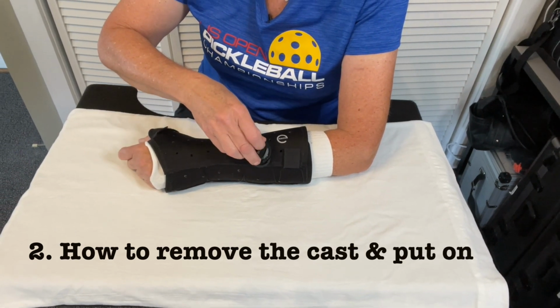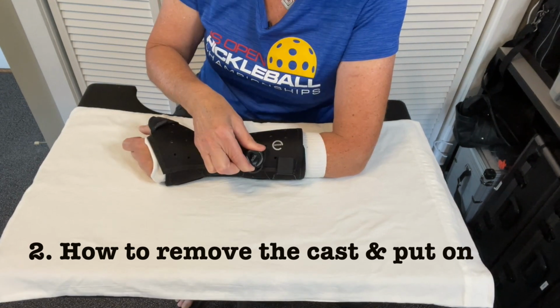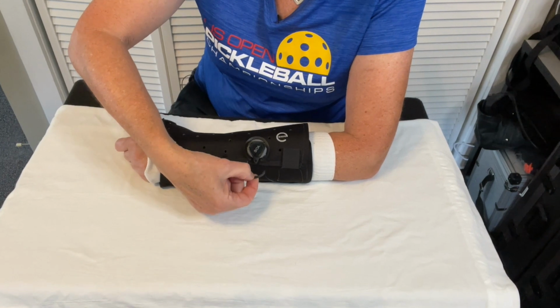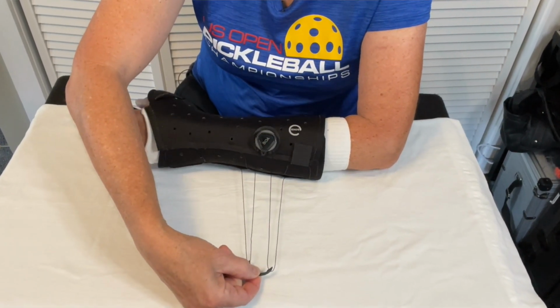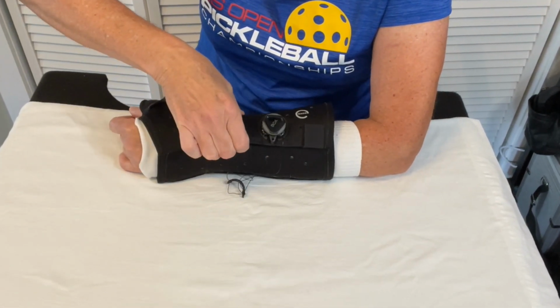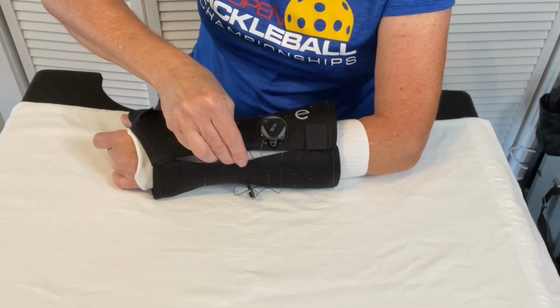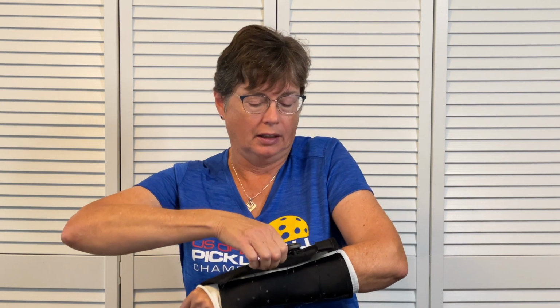To loosen it, it's pretty clever. So I'll show you here. This knob lifts up, and then there's this little half ring that pulls out, and there are these little micro wires or strings that allow it to loosen, and then this just pulls open as such. So now it's kind of like a clamshell. You can kind of see that here.